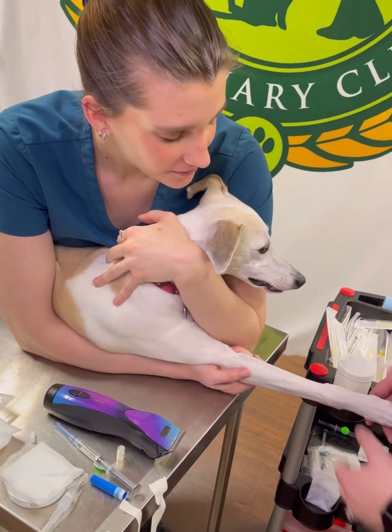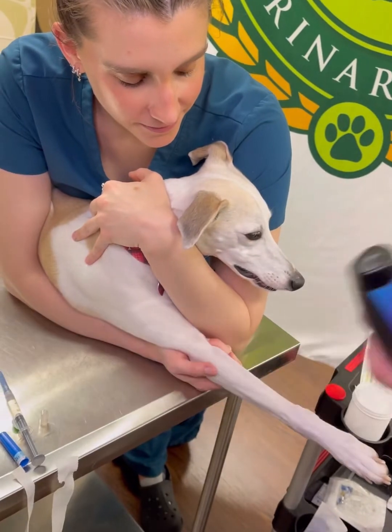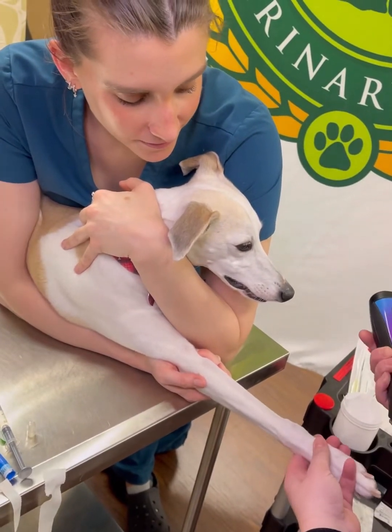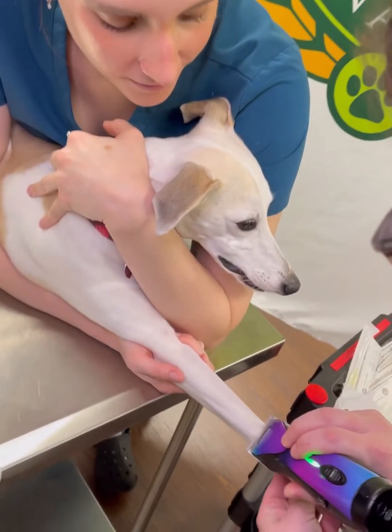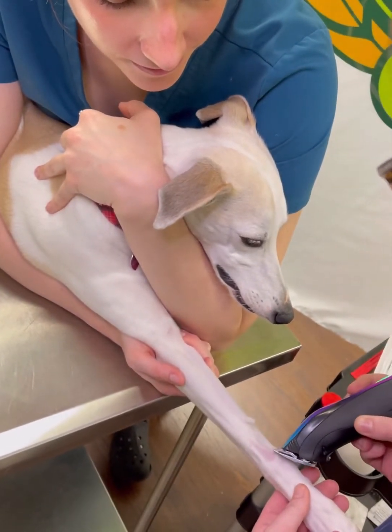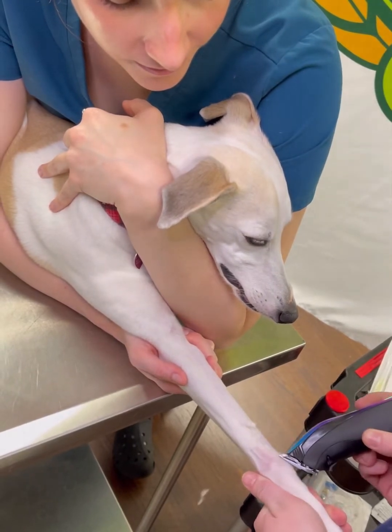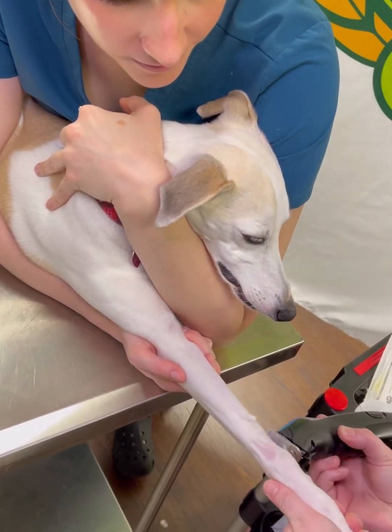When you start, you're going to bend the wrist as a good starting point. You're going to get your clippers and you're going to start to shave as small of a window as you can — nice and gently with the clippers. You're going to shave all the way around the leg.